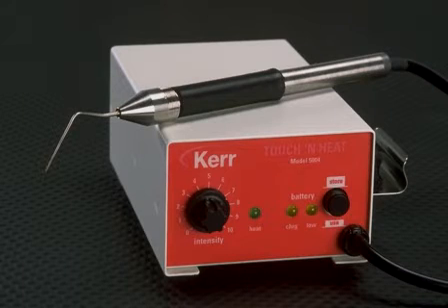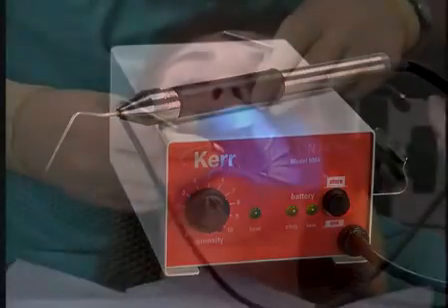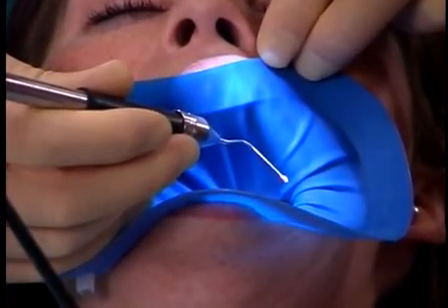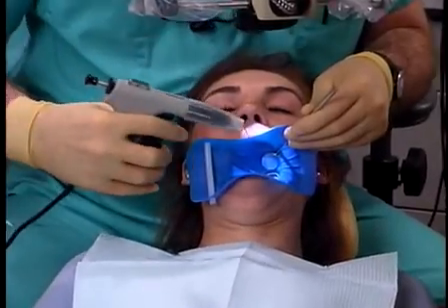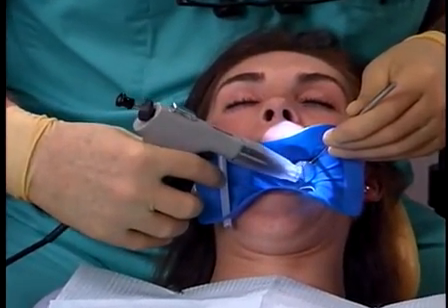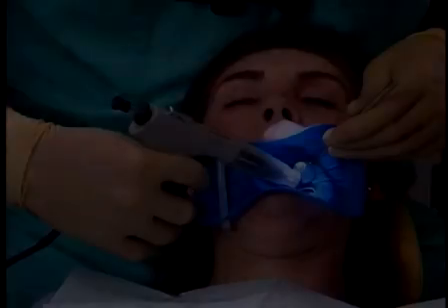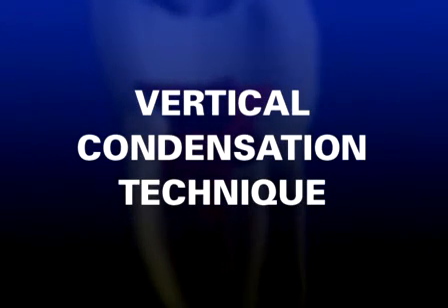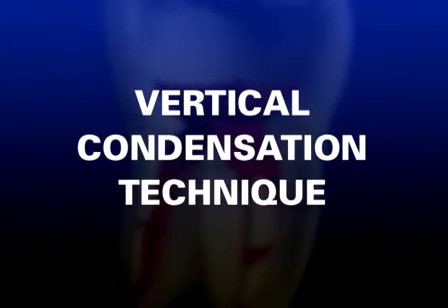Kerr's 5004 Touch and Heat is a heat transfer unit and is the device of choice for the warm gutta percha with vertical condensation technique. Great dental assisting is important during all steps of endodontics and particularly during the pack. The exchange of instruments benefits the economy of time. The gutta percha gun can be utilized to inject a uniformly thermal-softened segment of gutta percha into the root canal space. We'll talk about this shortly. Let's look at the sequence for packing warm gutta percha into a root canal system utilizing the vertical condensation technique.